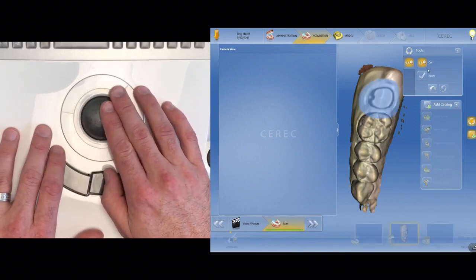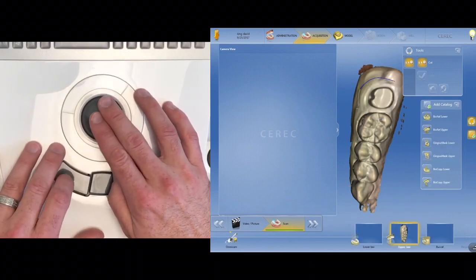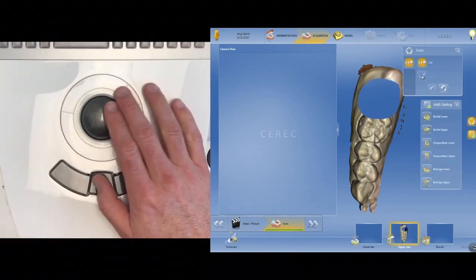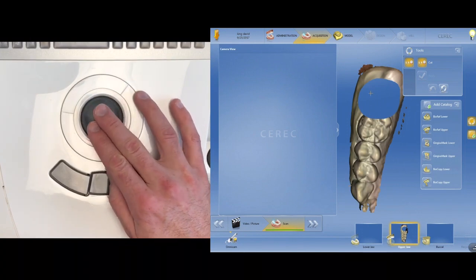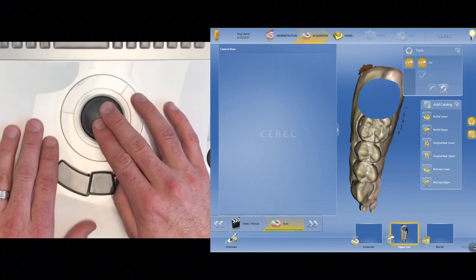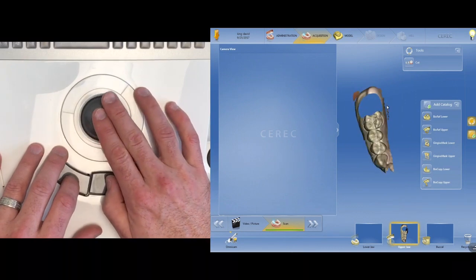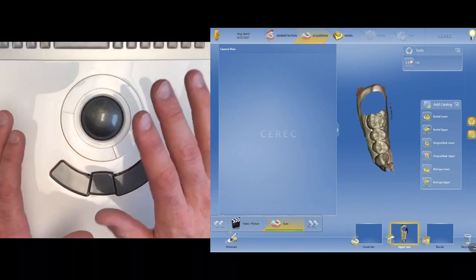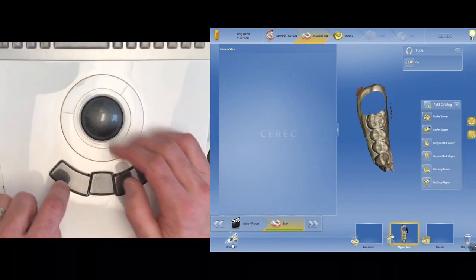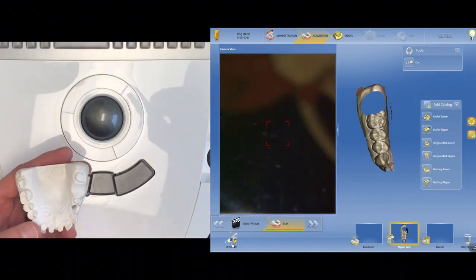All right, now if I like that cut, I can hit apply. If I don't, I can undo it and do it again. Hit apply. Now we have a big void there. Remember, your cut tool is still active, so you have to either turn it off there or right click there. All right, so now we have a big void in that. Now, assuming you've done the preparation, we're going to add those images back in. So let's turn on our camera, either the foot pedal or that left button. I'm going to grab the camera again. Remember, hold it carefully. It's an expensive camera.